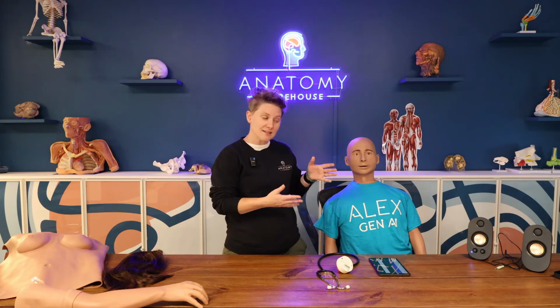Today, we're showcasing NASCO Healthcare's Alex Gen AI Patient Communication Simulator. This cutting edge platform uses the latest in generative AI technology to produce the most realistic and comprehensive communication training experience available today. Not only does it help sharpen your technical procedures, but it also develops the communication and empathy skills that are essential for patient centered care.